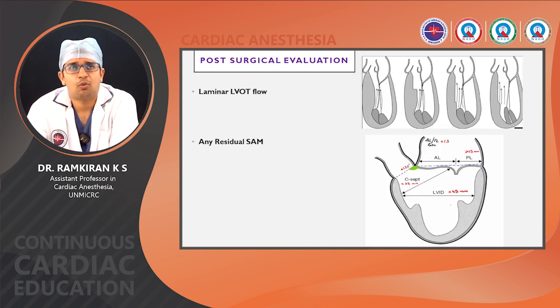Now in the post-op, post-surgical evaluation is very important in such patients. We have to have a laminar LVOT outflow. As you see, the initial picture showed the jet directed posteriorly with turbulent flow.